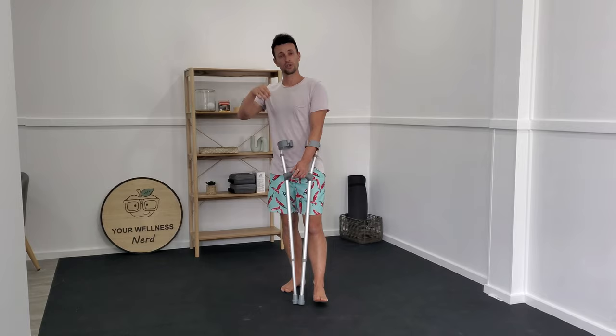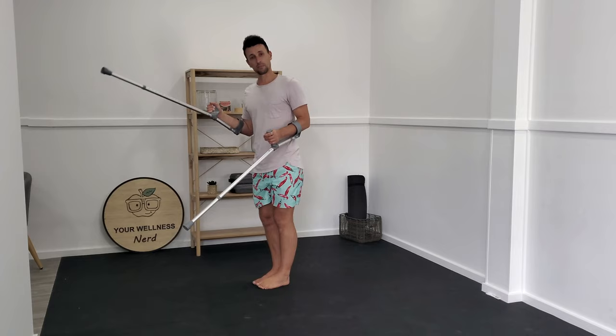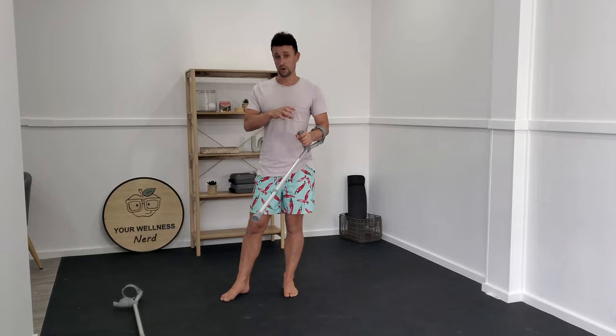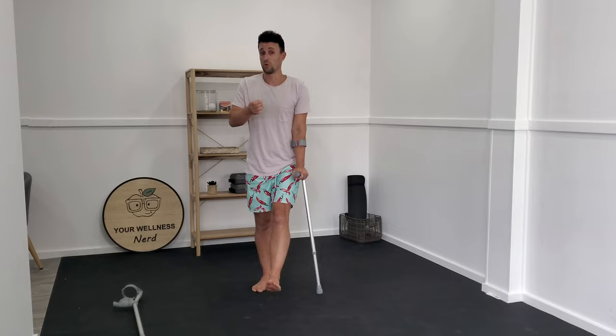Once you feel like you've got a good understanding of how to load up your tissue respectfully with your crutches, there may come a point where you feel you can't go straight from two crutches to zero, and it might benefit you to progress to one crutch first. A common question is which side does the crutch go on. Interestingly, one elbow crutch, one underarm crutch, or a walking cane has to go on the opposite side to the one you've hurt — which may be counter-intuitive. If you've seen the TV show House, he always walks with the cane on his affected side, which is poor mechanics.